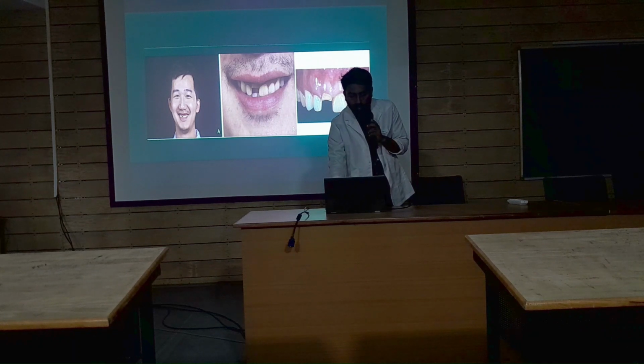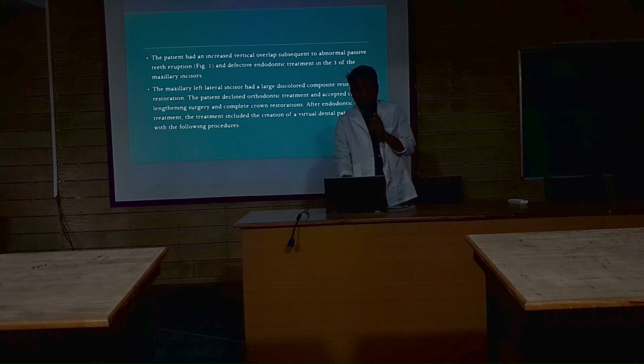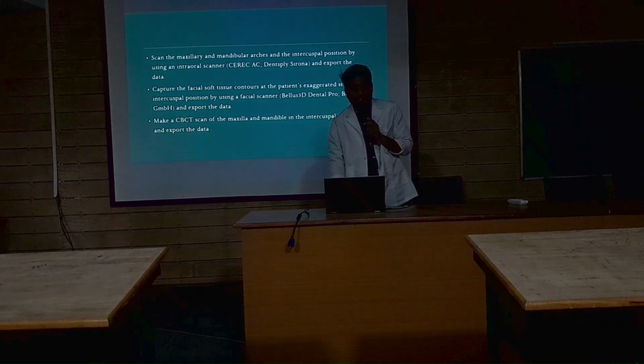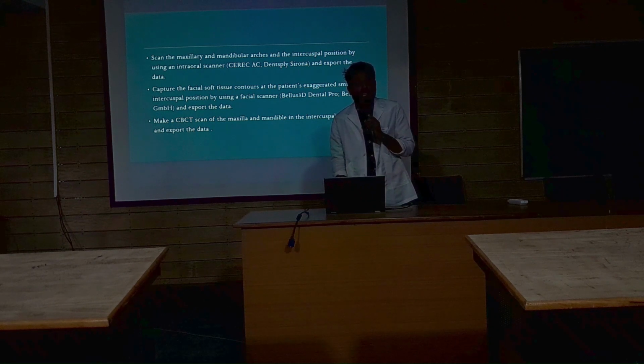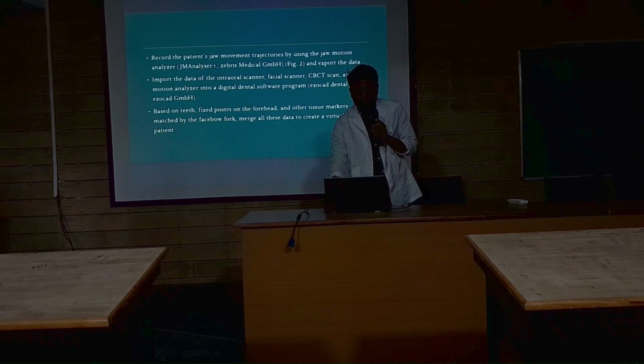So it will be difficult to do composite restoration. The maxillary left lateral incisor had a large discolored composite resin restoration, and the patient declined orthodontic treatment and accepted crown lengthening surgery and complete crown restoration. After endodontic treatment, the treatment included the creation of a virtual dental patient. So we see the following procedures. First, we scan the maxillary and mandibular arches and the intercuspal position using an intraoral scanner. Then we do the extraoral scanning, and then we do a CT scan in the intercuspal position.